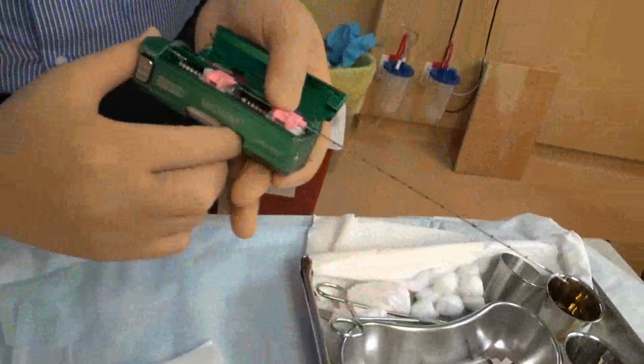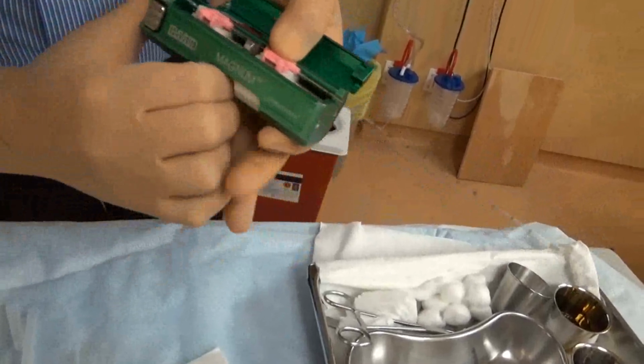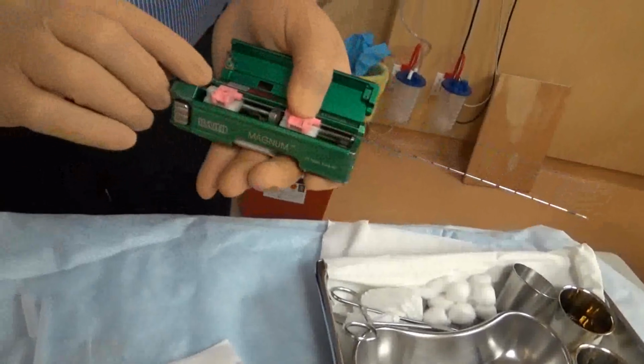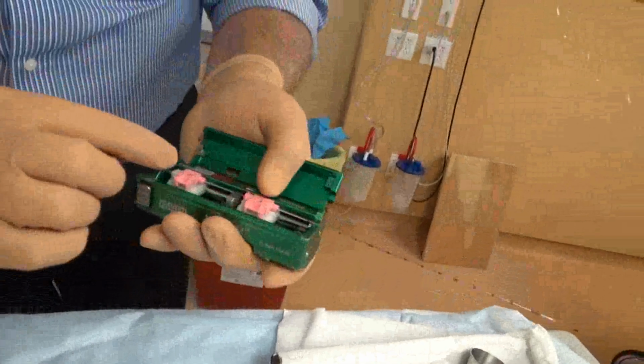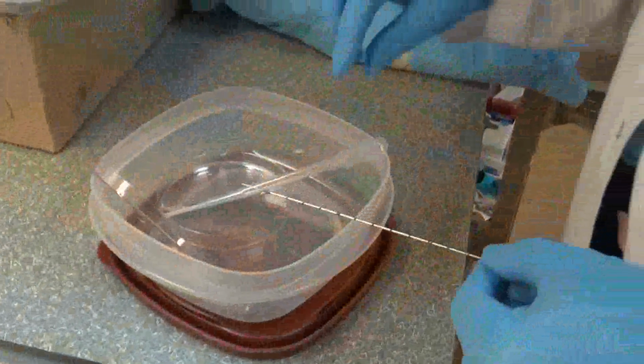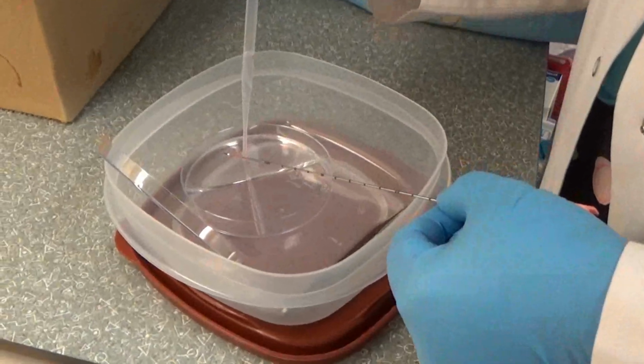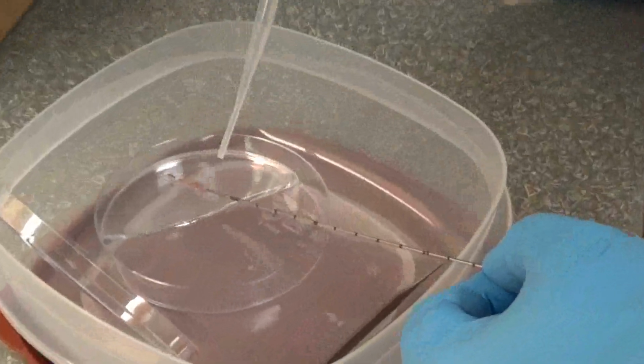So when you prime it, you bring back your cutting needle first, your gauge needle second, and then when you click it, that goes forward, and then the cutting needle goes over it. Here is our technician receiving the biopsy. You can see she is removing the kidney tissue from the needle with saline.